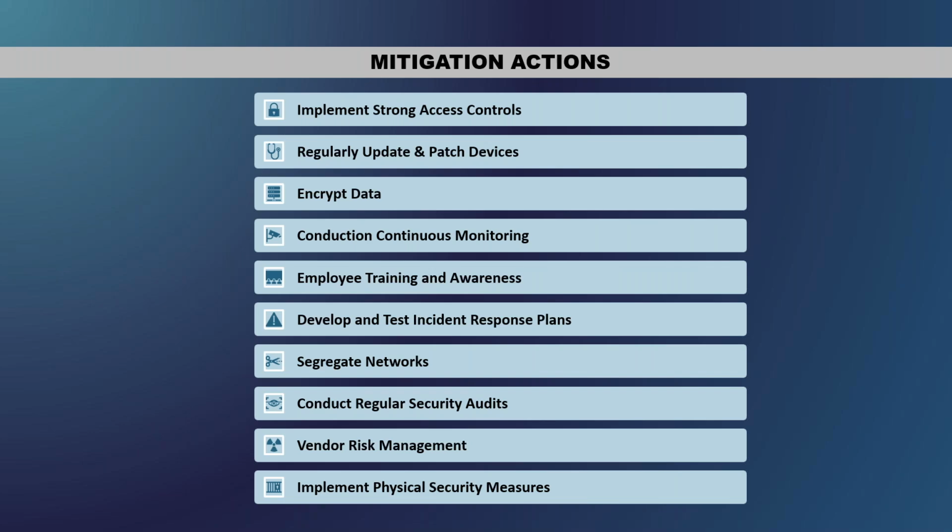Encrypt data, so employing end-to-end encryption for data in transit and at rest, using secure protocols like TLS or SSL. And then conducting continuous monitoring, implementing real-time monitoring tools to detect suspicious activity, setting up alerts for unauthorized access attempts.